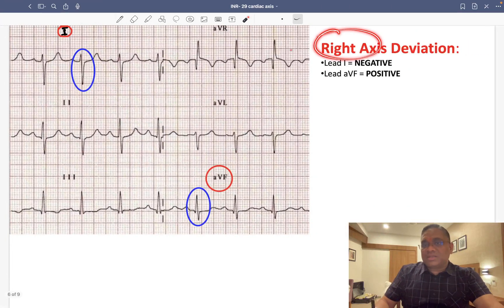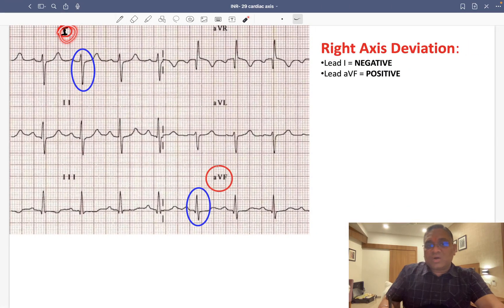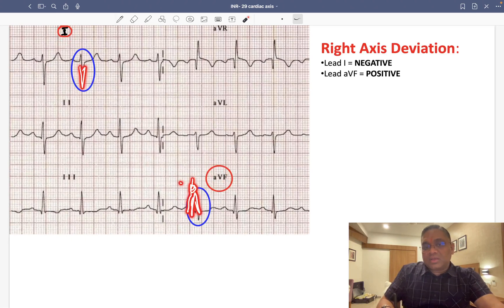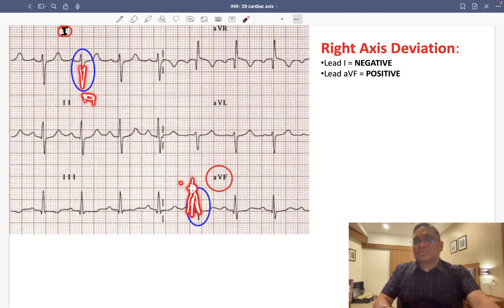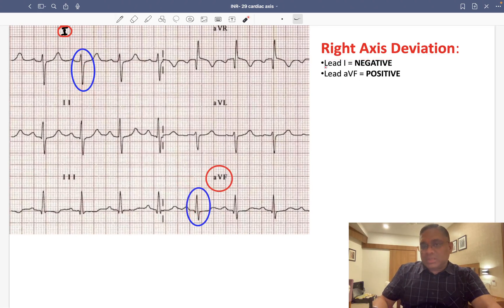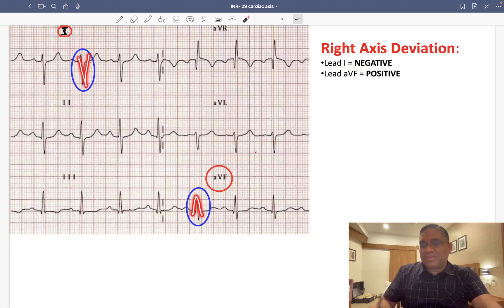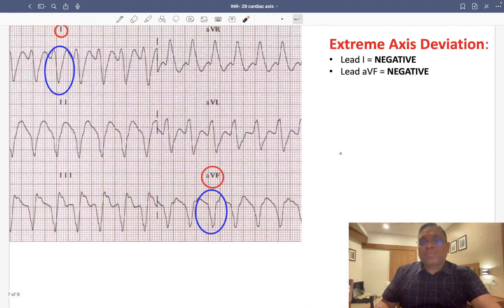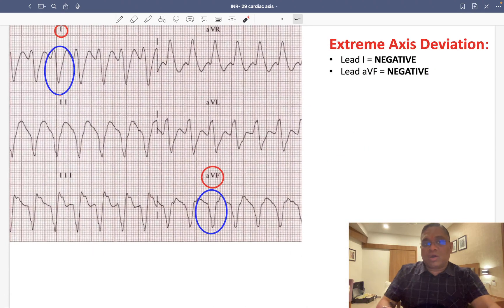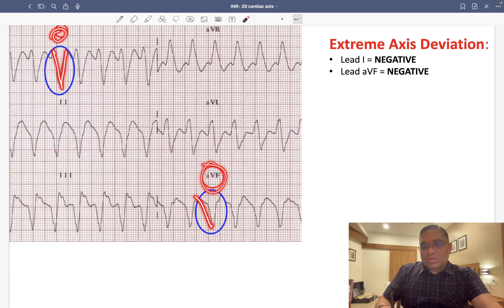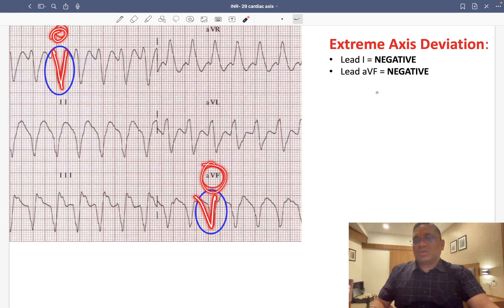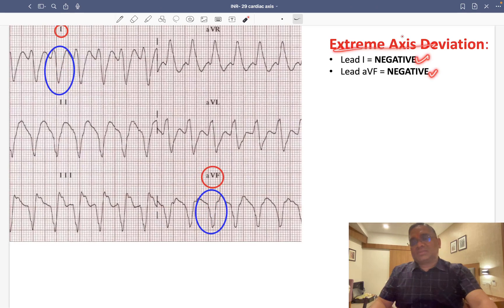For right axis deviation: the tips of QRS in leads 1 and AVF are reaching towards each other — lead 1 has negative deflection and AVF has positive deflection. That confirms right axis deviation. For extreme axis deviation: both lead 1 and AVF show the QRS complex going down — look at the tip of the R wave, both are negative, confirming extreme axis deviation.